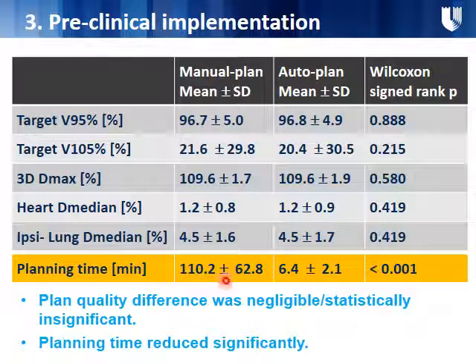But planning time was reduced dramatically. It was about 2 hours for manual planning, and for auto planning, we spent about 6 minutes. So we achieved our goal. We made treatment planning very efficient.